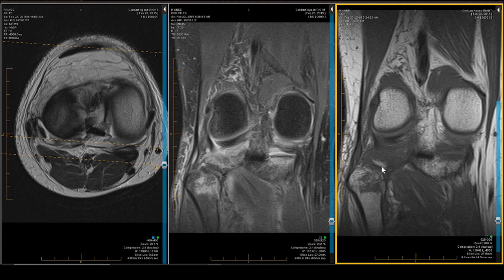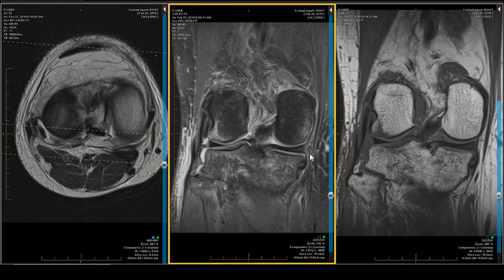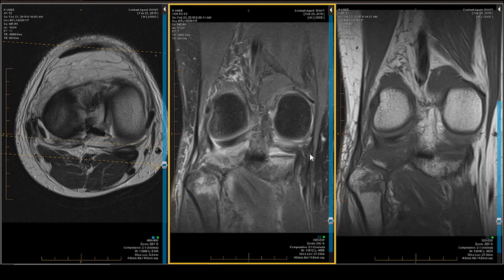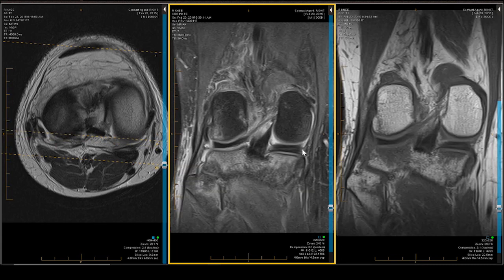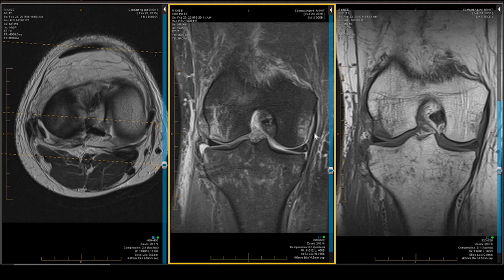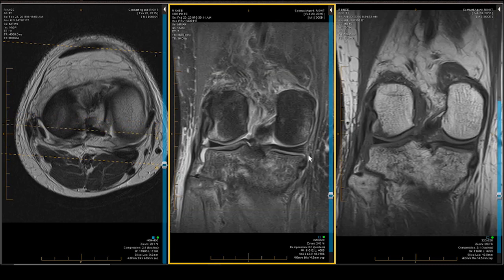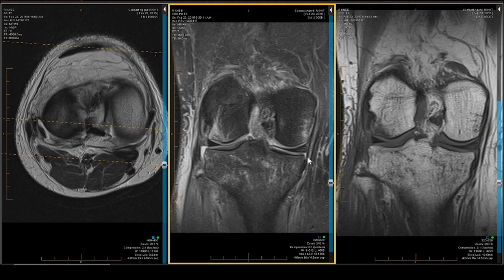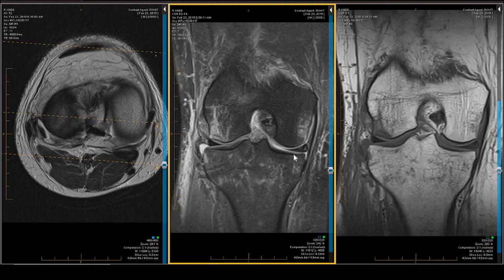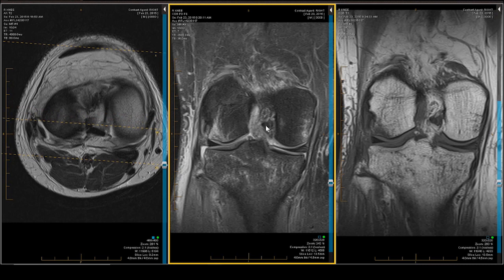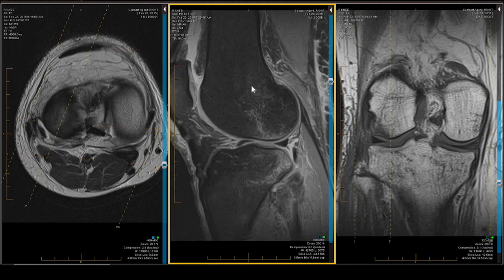Let's briefly look at the posteromedial corner, which has a little bit of swelling associated with it. The middle layer of the MCL — tibial collateral ligament — is normal. The superficial layer is normal. The meniscofemoral ligament is normal. The meniscotibial ligament — there it is — it's visible, it's present and accounted for.